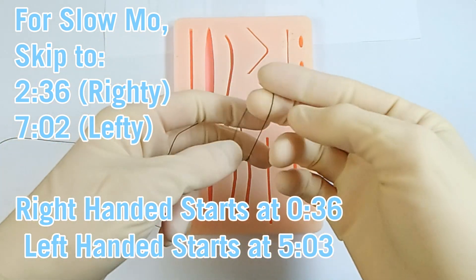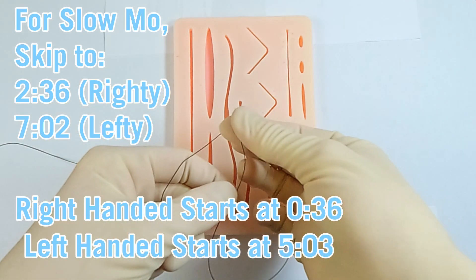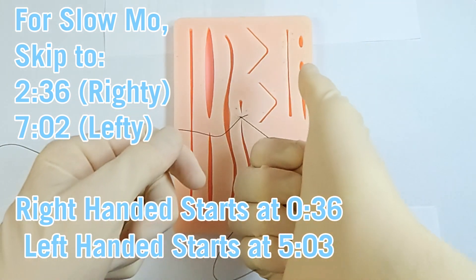An important thing about gripping is you only want to be gripping between fingertips — whether that's thumb and index, thumb and middle finger, or between a middle finger and a ring finger. You just don't want to be gripping with your whole hand because you won't have much traction.